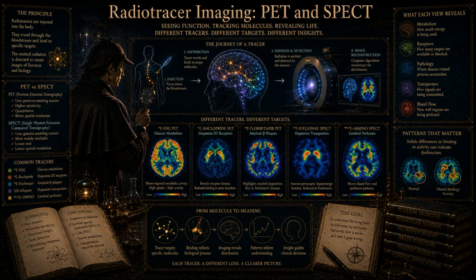A bias. Yeah. Particularly in areas of the brain with very low levels of radioactivity, OSEM can sometimes suppress the signal too aggressively or fail to strictly preserve the linear proportionality between a highly radioactive region and a low radioactive region. It massages the data to make it look good. Exactly. And if you are a clinician trying to spot a tumor, OSEM is perfect. You want a clean image.